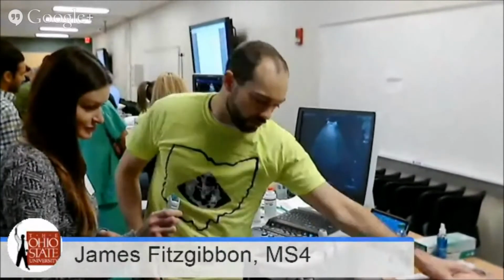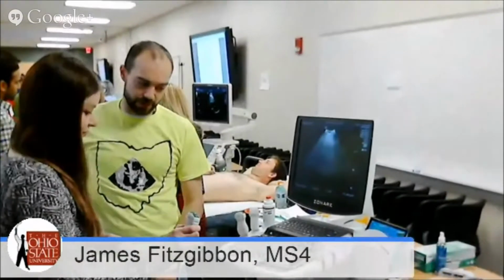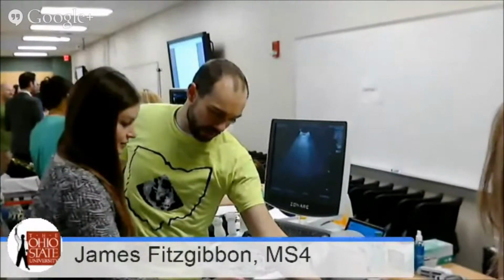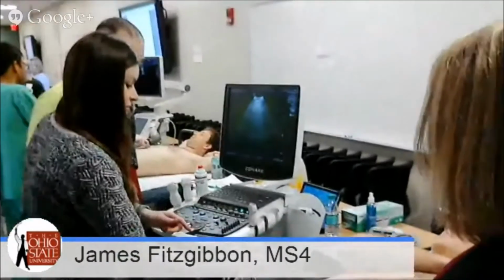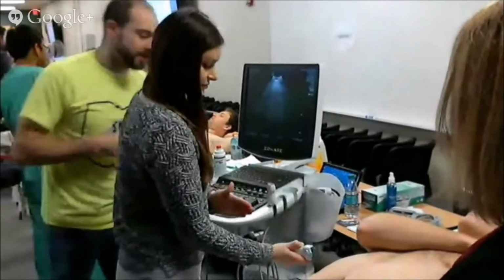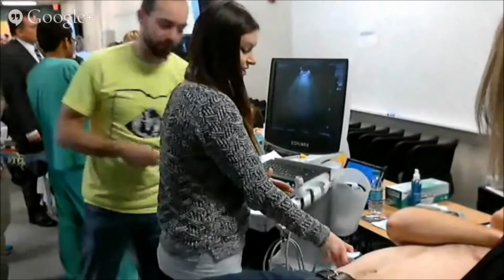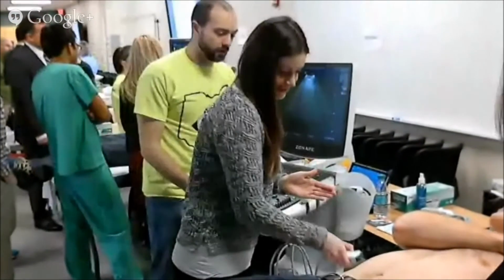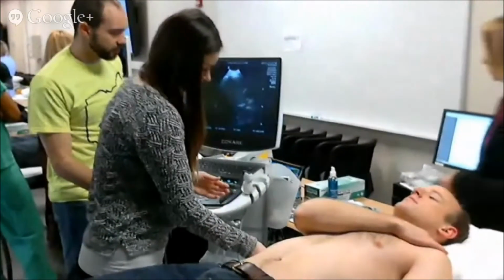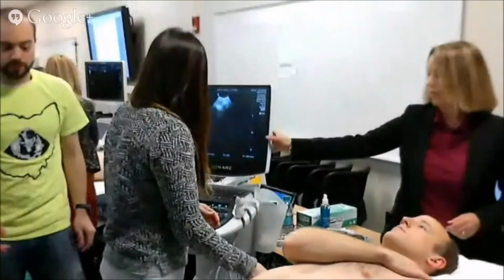What I'd like you to do is one of the first images in the FAST scan, which is the hepatorenal view. So go ahead and just stick it on, with the leading edge towards the patient's head, like that. Perfect. So get comfortable in a position where you can see the screen.